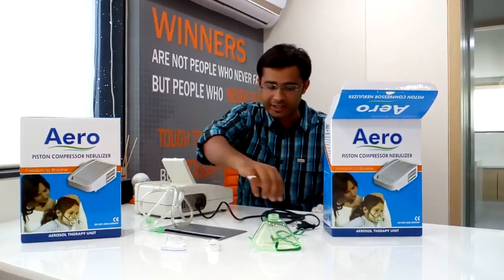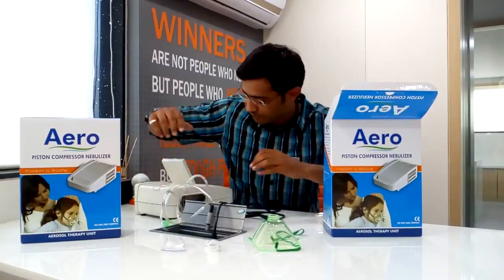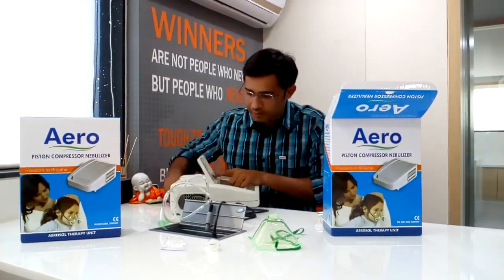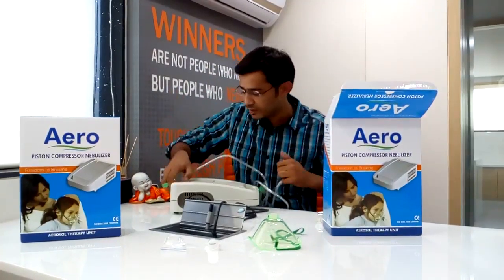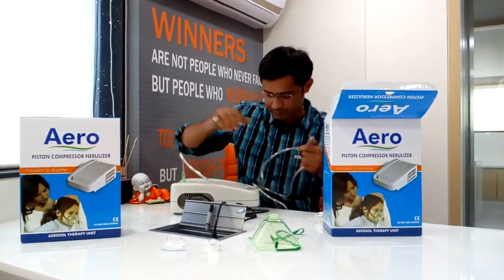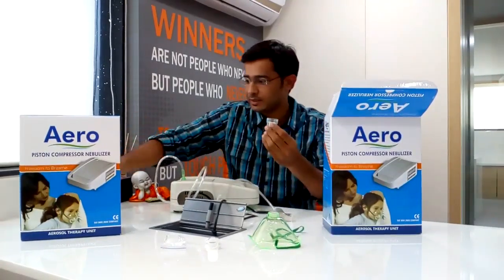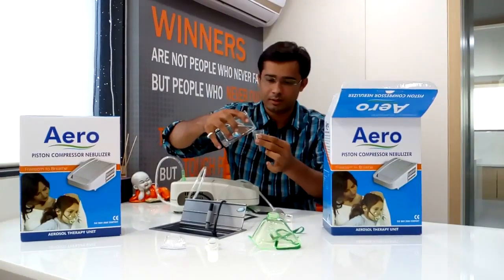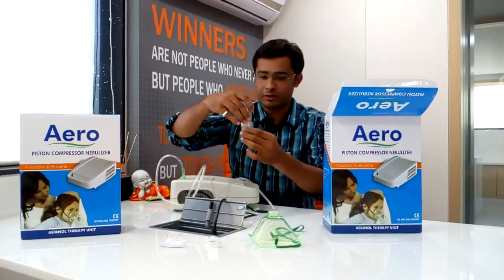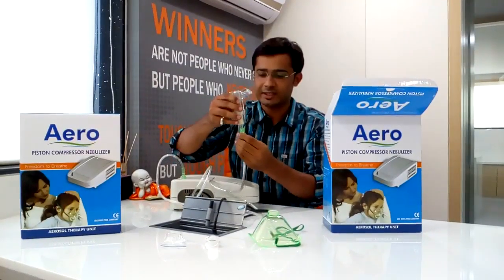Now I will show you how to assemble this. You need to connect it to the power cord. There is an on/off button given inside. The tubing is to be connected. It is connected. Now you have to fill medicine in this compartment. It is locked in this way. Check that the tubing is connected like this.